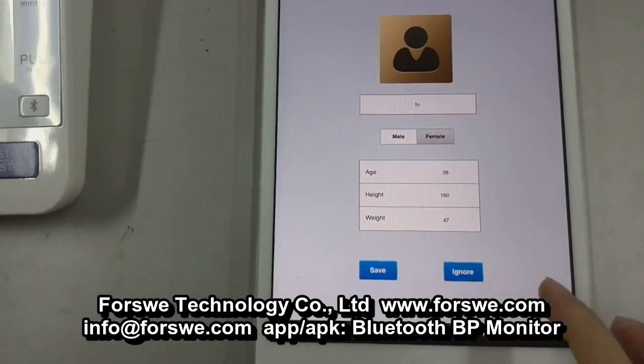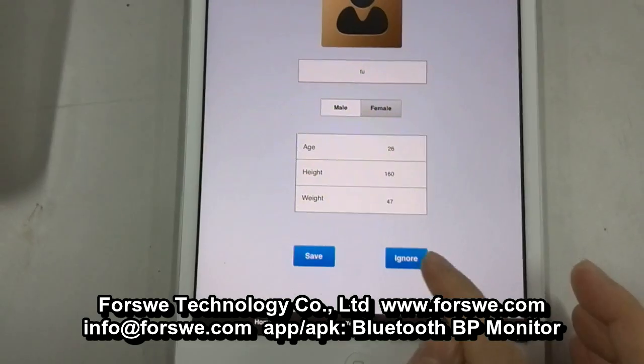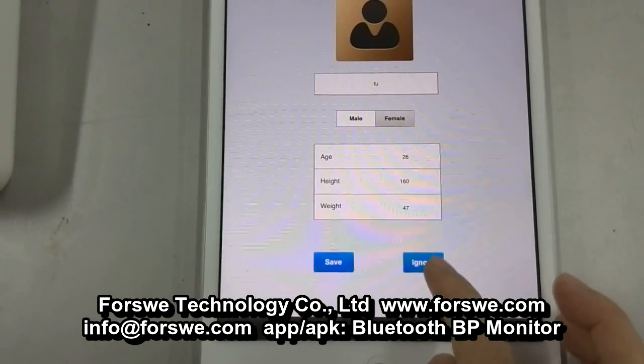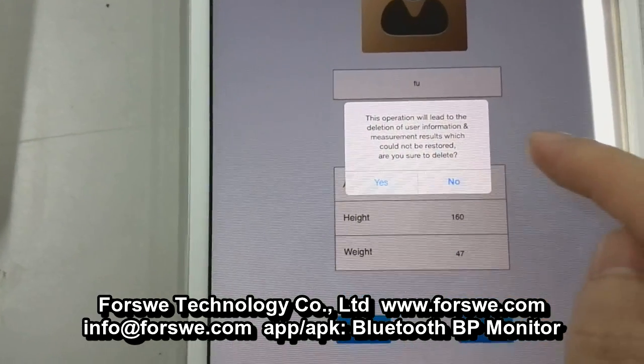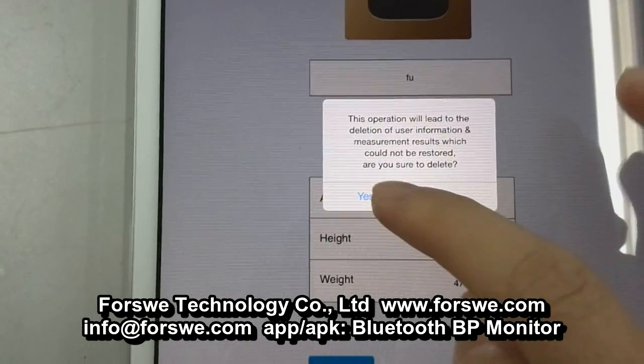Or if you want to cancel or delete the user account, just choose the button Ignore. If you choose the button Yes, then all the records of this user account will be totally deleted.